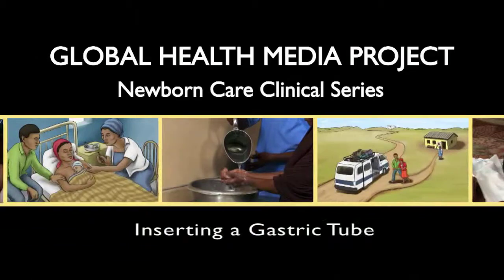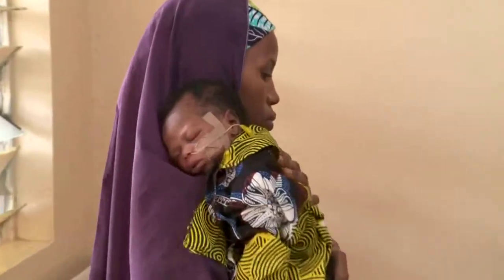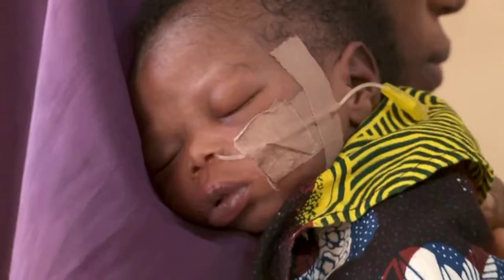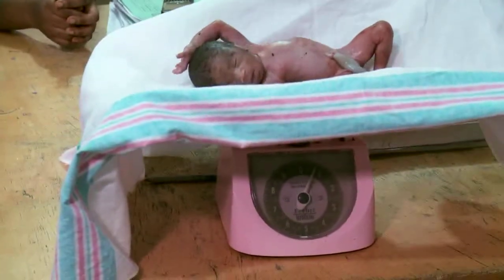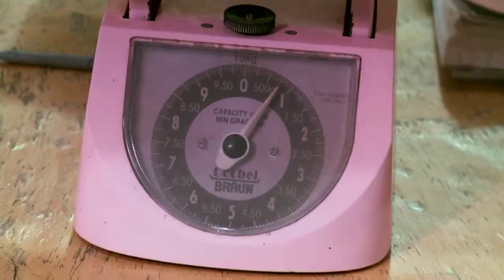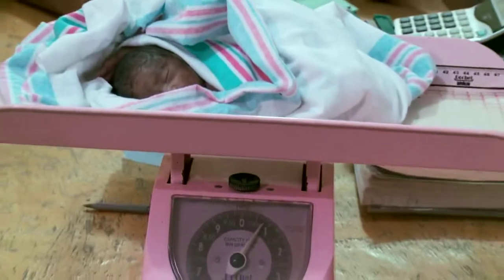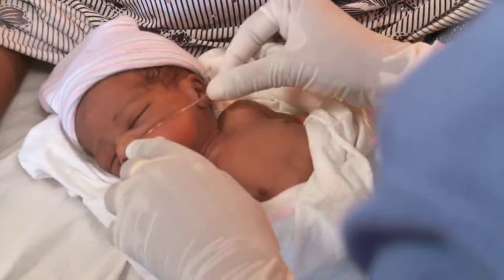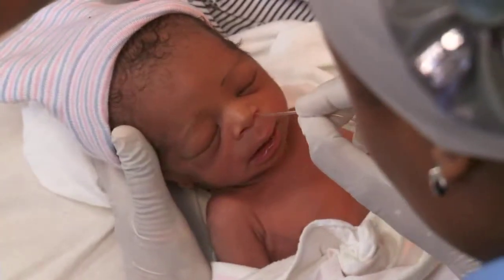Inserting a gastric tube. A gastric tube is a way to feed babies who are not able to effectively suck or swallow enough milk to thrive. They may be too sick or born too early to be able to coordinate the complex skills of sucking, swallowing, and breathing that breastfeeding requires. This video shows how to determine if a gastric tube is needed and how to safely insert one.